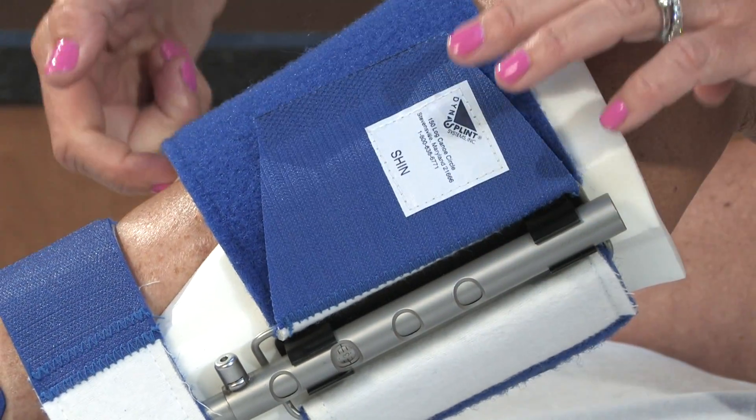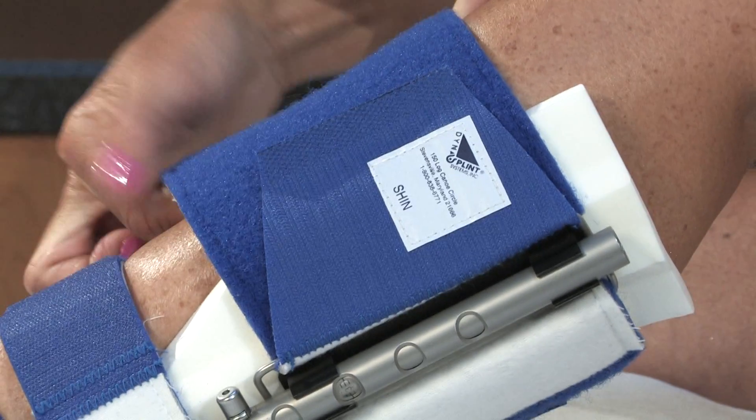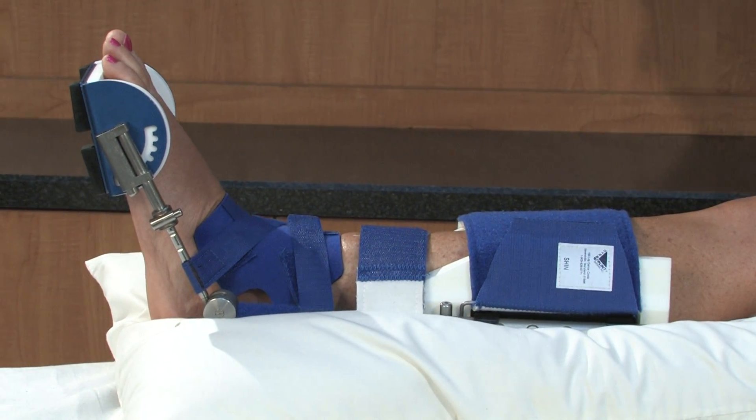Finally, attach the shin cuff by running through the D-ring and attaching to itself. You should be able to slide a finger between the cuff and your shin. To support your leg, place a pillow under your calf.